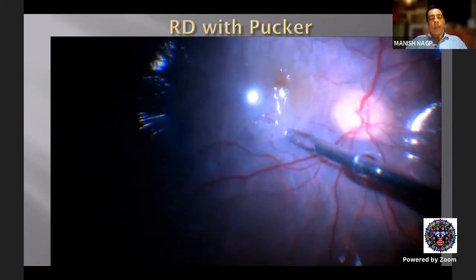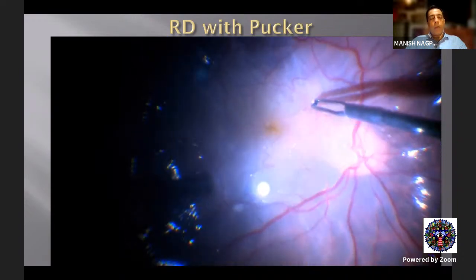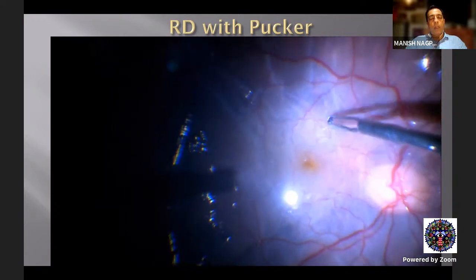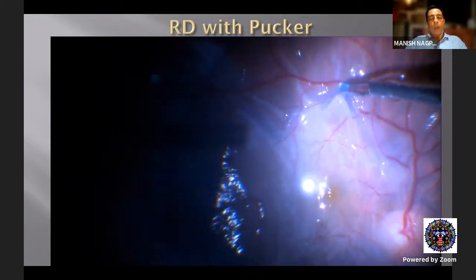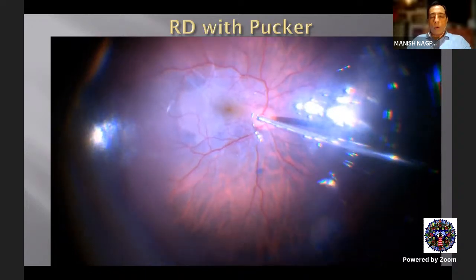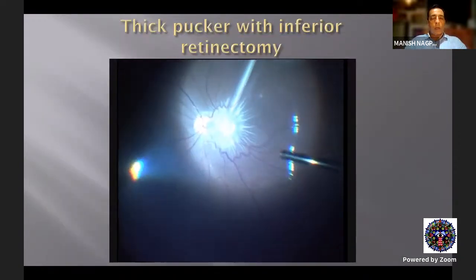And you can see here that as we move, you can see the membranes or the ILM coming up, being peeled off, and then the retina looks healthier and better in terms of the wrinkling and the folds as we keep on expanding it. So this is a technique that Stano had taught us, that you stain with the brilliant blue and look for these in PVR cases, especially early PVR cases.